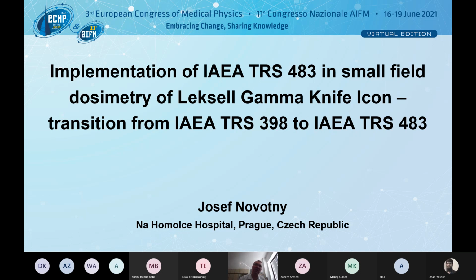So that's a very different compared to when I used to work with Linac or CyberKnife, where some parameters could be changed, some parameters could be manually influenced, but mostly it was this communication through those volumes and constraints, especially in the case of CyberKnife.